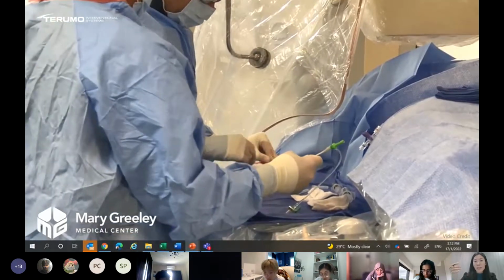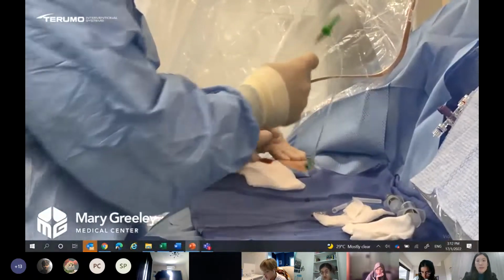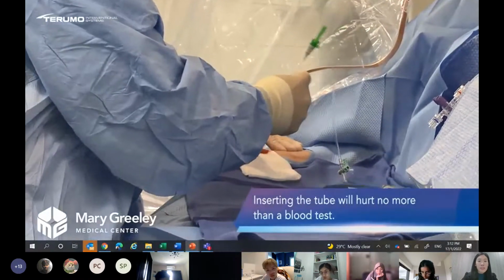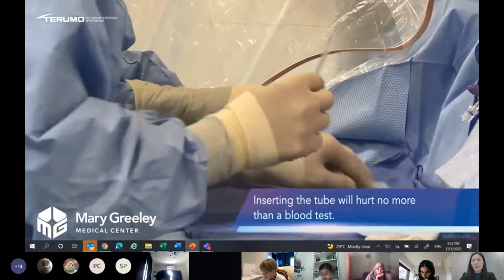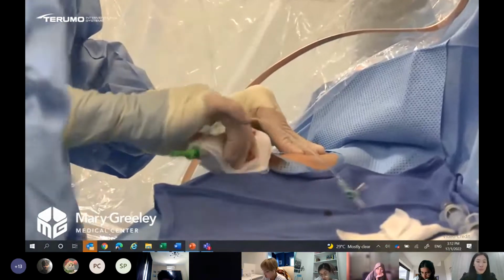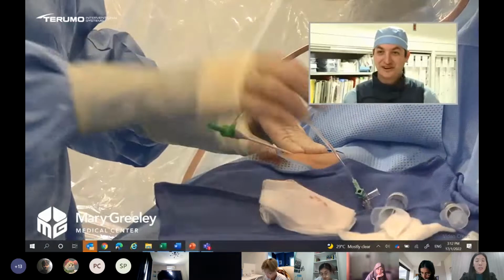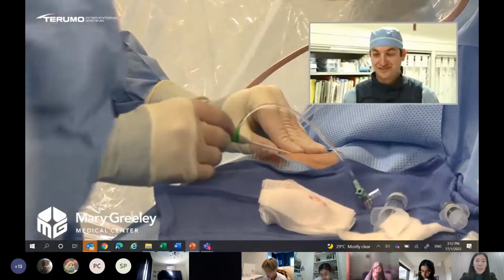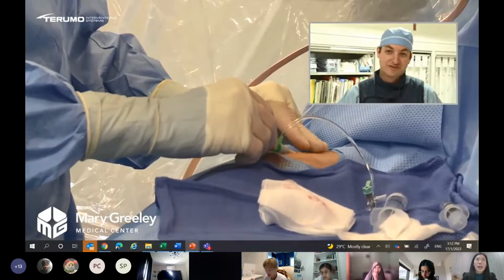Now he removes the puncture needle, and he will put the assembled insertion sheath through the mini guide wire. So that's how the introducer sheath is actually introduced, right? After the puncture needle, through the mini guide wire. He will now push this insertion sheath or introducer under the skin into the blood vessel until the whole shaft is under the skin.